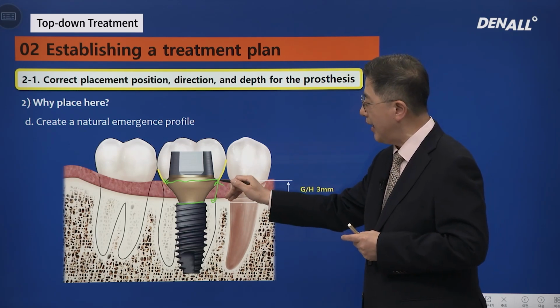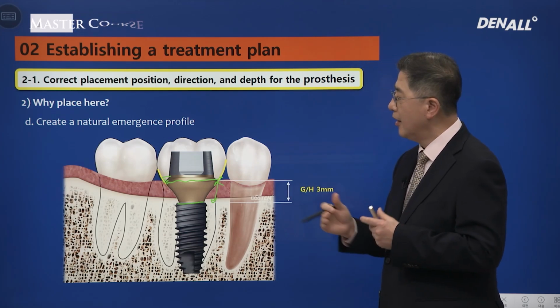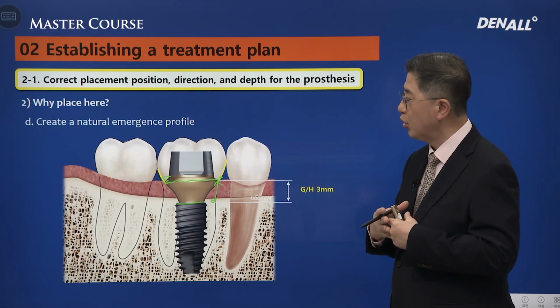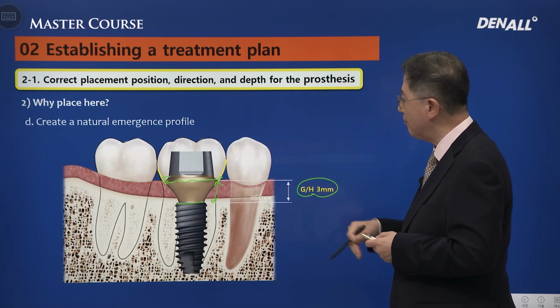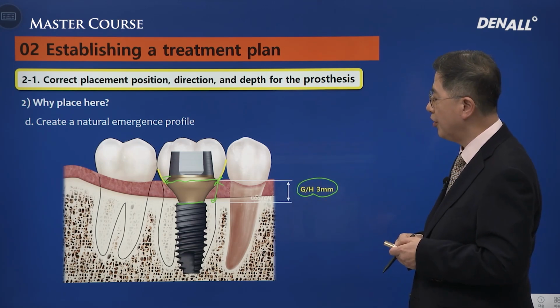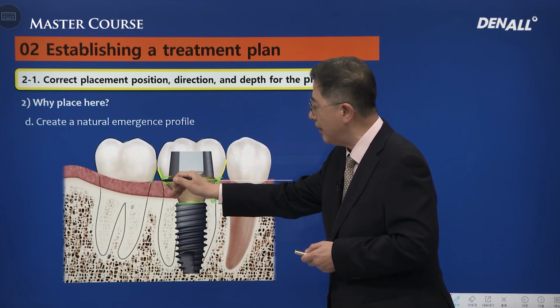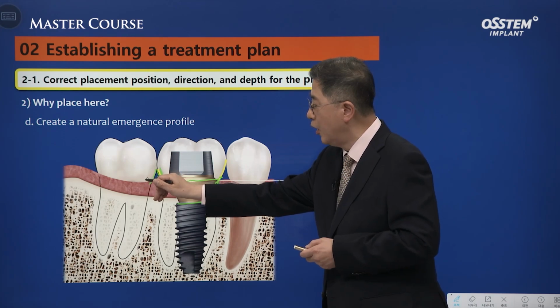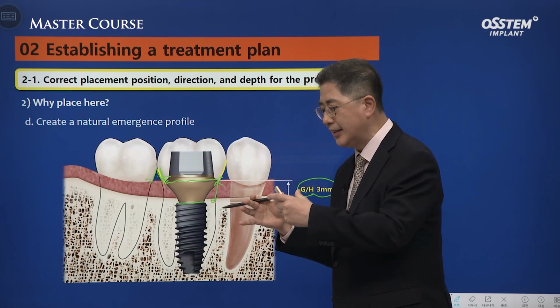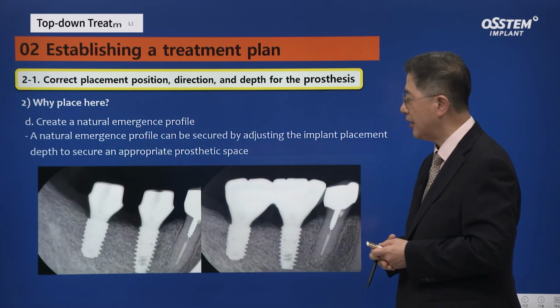This is when it is a supramargin. Buccolingual dimension becomes reduced. Gingival height needs to be at least 3 millimeters to be able to use a 7 millimeter implant. This is to mimic natural teeth, but personally, I think you need to use an abutment diameter that is much less than natural teeth.